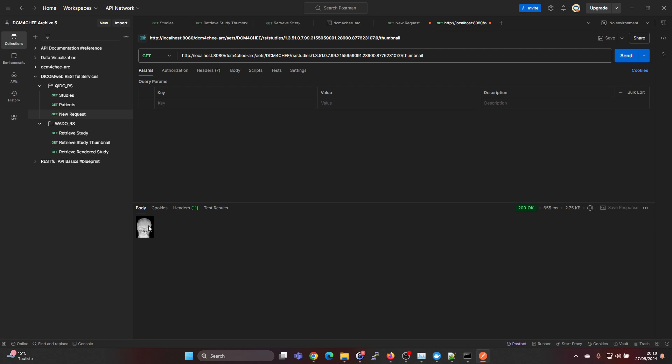Now we can see that we actually got a thumbnail of the study. If you're seeing thumbnails in a DICOM viewer, most likely it's using this interface to get those. It's only 2.75 kilobytes, so that's very lightweight.